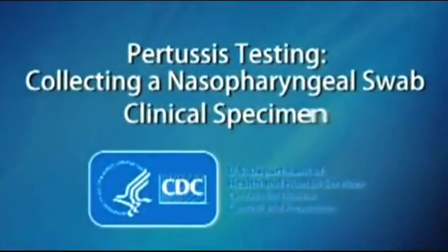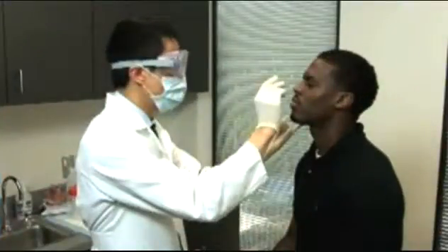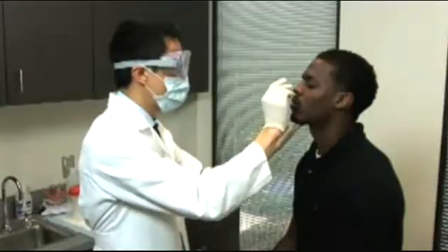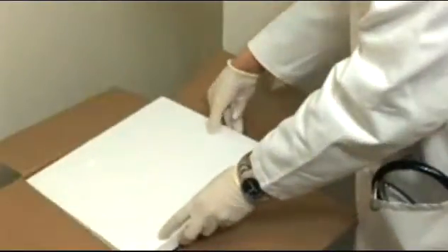Pertussis testing: collecting a nasopharyngeal swab clinical specimen. It is essential to use correct technique when collecting and transporting specimens for laboratory testing. This video will demonstrate how to correctly collect and transport a nasopharyngeal, or NP, swab.